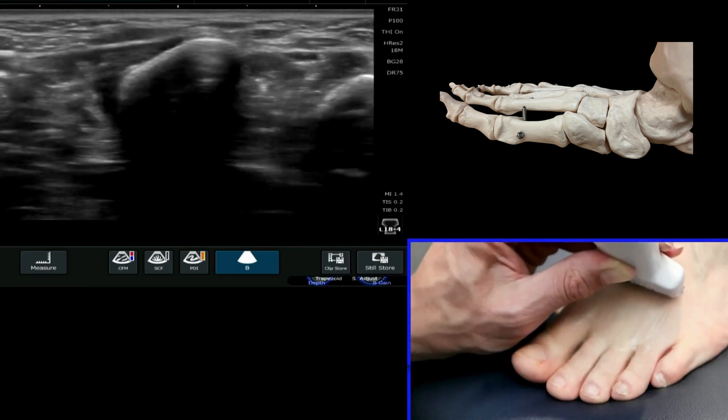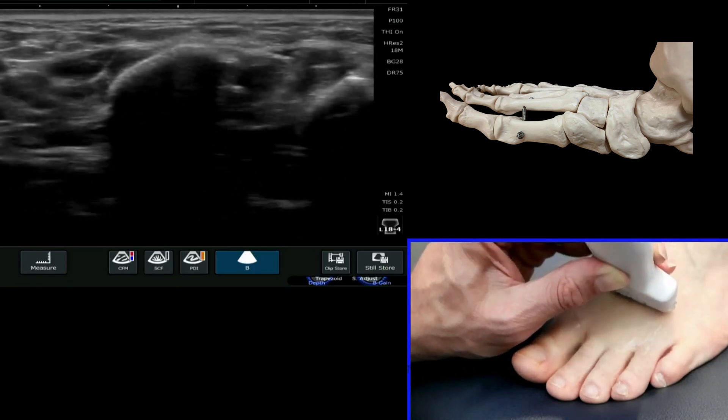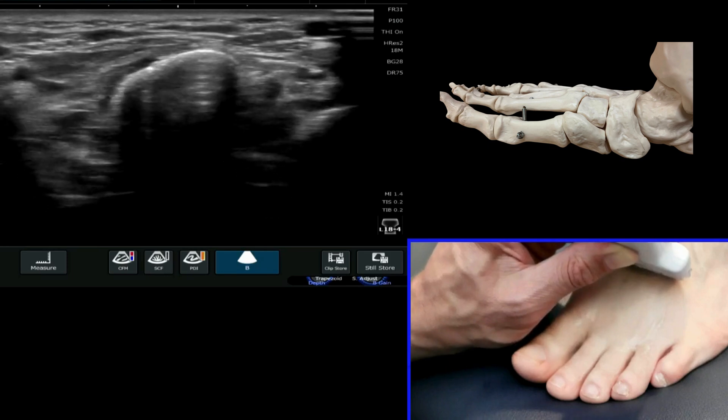Run back up and look at that cortical outline — looking for a smooth outline, no hypoechoic fluid collection superficially, and no jagged edges to that cortex. It should be nice and smooth.